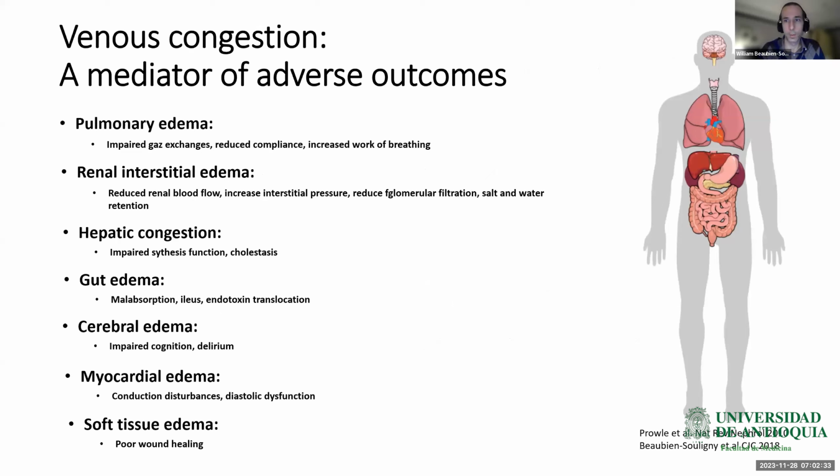We showed that abnormal portal flow pulsatility happens frequently in cardiac surgery patients, up to 18% of patients in the operating room after cardiopulmonary bypass. We also showed that portal vein pulsatility was associated with hemodynamic and echocardiographic signs of RV dysfunction.